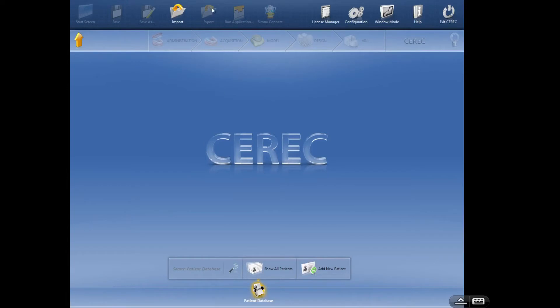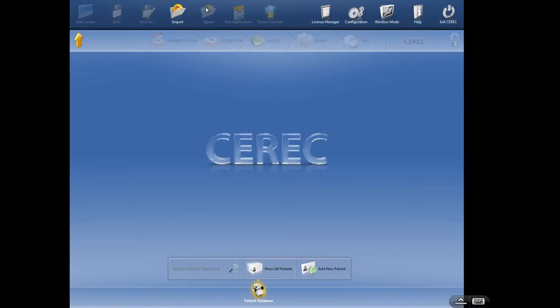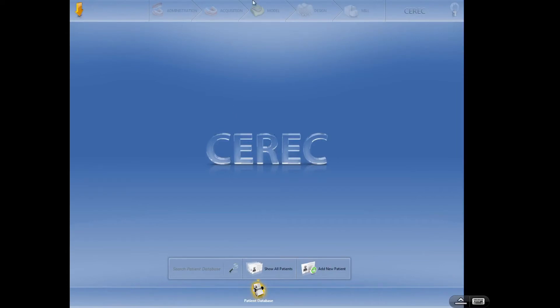Export: if I've already designed a restoration, a profile, or a set of crowns, I can export that. The nice thing is the different versions — in 4.5 — will allow you to export as more than just an RST, so we can actually import it into a 3D printer to print. This is not something we use very often unless you're doing 3D printing or creating guides. Mostly I use export if I want to do a backup or move a case from one CEREC machine to another — I'll export it, grab that file, and put it on a thumb drive.